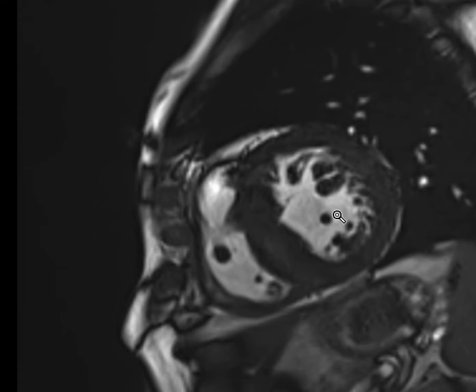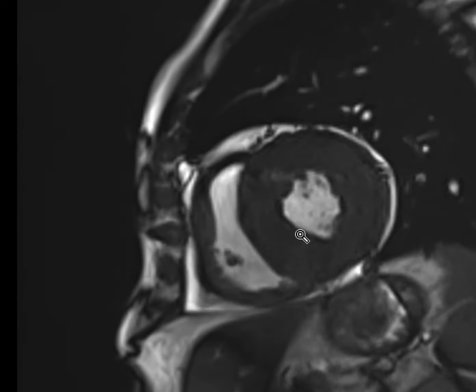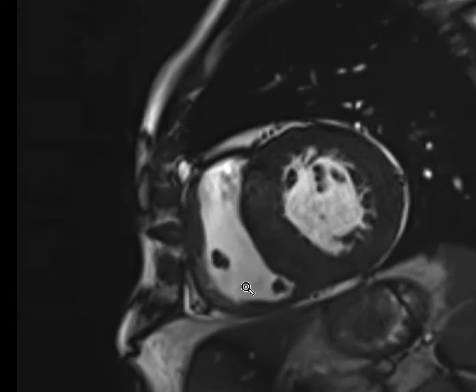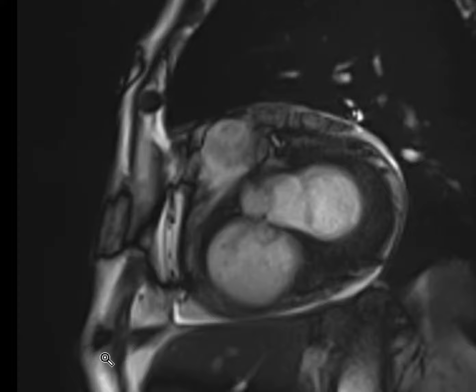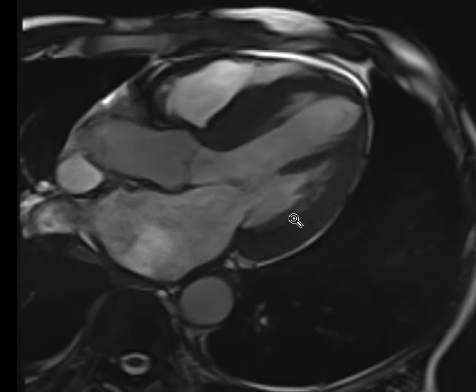Let's go to the short axis again to show the hypertrophy of the left ventricle. It's more evident along the septum. The RV is also mildly hypertrophied. Three-chamber view showing again the hypertrophy of the left ventricle.